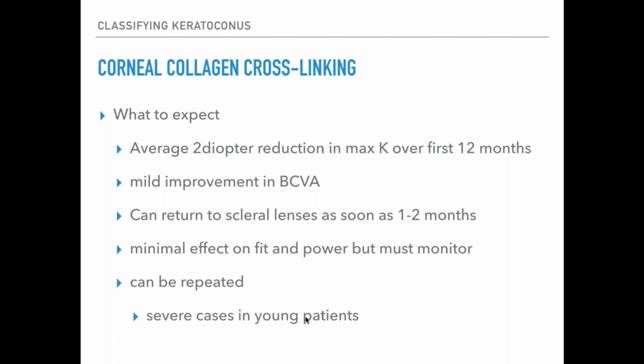So I found change, but very little change following cross-linking in these patients. So I'll go ahead and fit them ahead of time. They'll be out of sclerals for a month to 2 months afterwards until they're comfortable, and the ophthalmologist sends them over to me usually about a month out, and I'll put them back in sclerals at that time. And then I'll watch them for changes in fit and power. But usually it's going to be very mild.